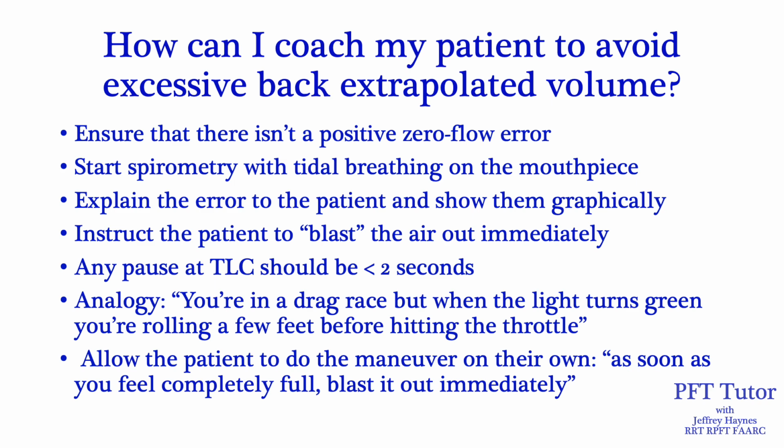Of course, you want to explain the error to the patient and show them graphically, as I just did on the previous slide. It's always important to instruct the patient to blast the air out immediately. Don't blow, don't push, blast it out immediately. If the patient takes that full breath in and they hold their breath at total lung capacity, that should always be less than 2 seconds. The longer they hold their breath, the more likely they're going to leak.